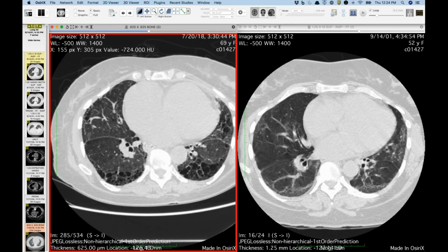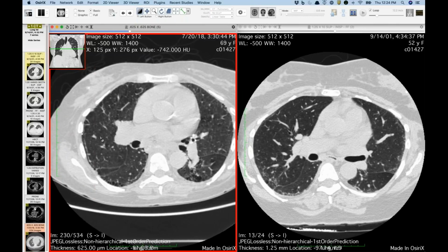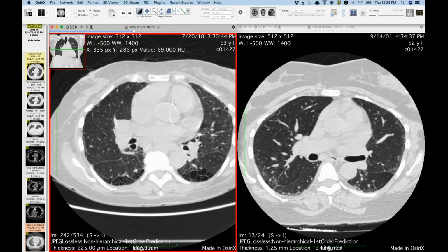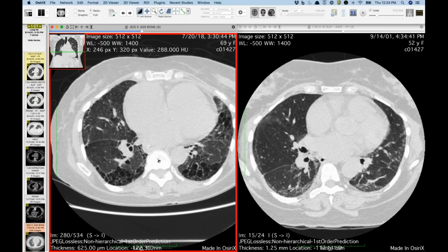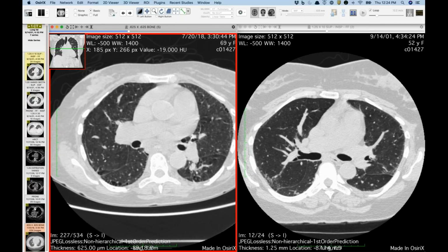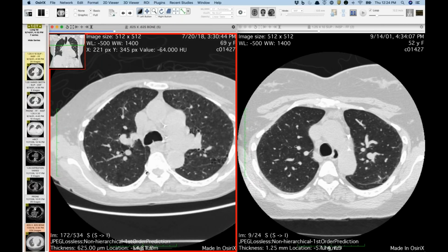And I think the background of ground glass is probably just pulmonary hypertension, because they have connective tissue disease. You can see their pulmonary artery is huge. So they've probably got a combination of group one pulmonary arterial hypertension from an arteriopathy, and then maybe some contribution from lung disease.